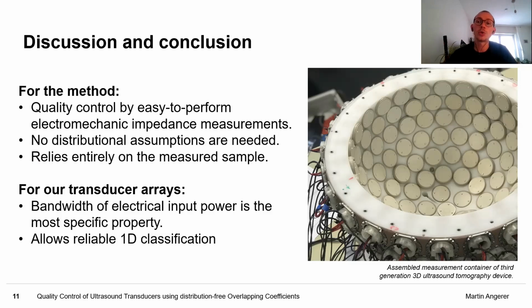It allowed us now to assess the quality of the fabricated transducer arrays to be now used in our 3D ultrasound computed tomograph for breast cancer screening.